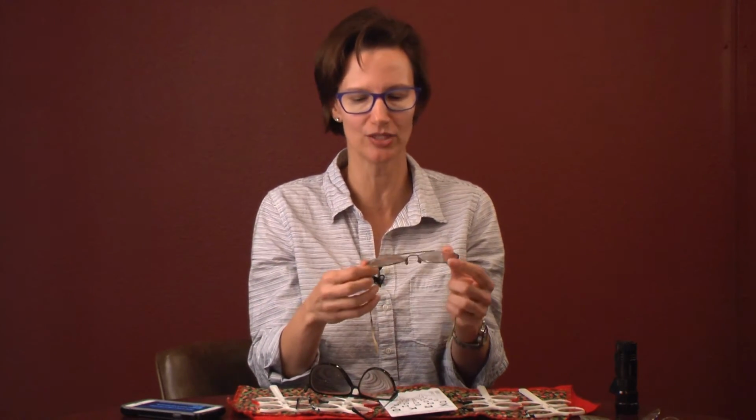That's the last thing you're going to check. You check the temples, you check the nose pads, make sure there are pads, and then look at the lenses. Are they super scratched? If they're super scratched, you don't want to give them scratched lenses either. Kind of think about what you would actually wear, and would you be able to tolerate that. All of the things that you can manipulate on these, typically you can. You're just pushing them with your fingers, kind of opening them up.